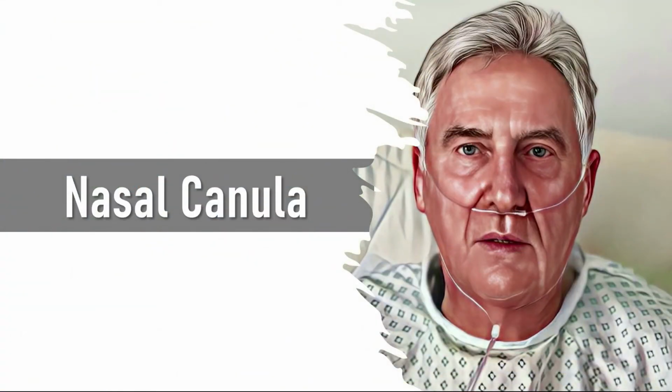Nasal cannulae are made up of a pair of 1 centimeter prongs that point upwards into the nostrils. The tubing is positioned either circling the ears or wrapped around the head, as long as they're fixed in position, and fresh gas is delivered via a flow meter on the wall.